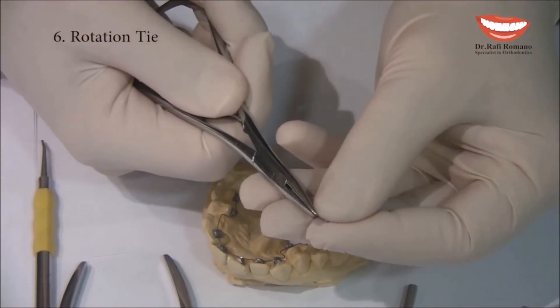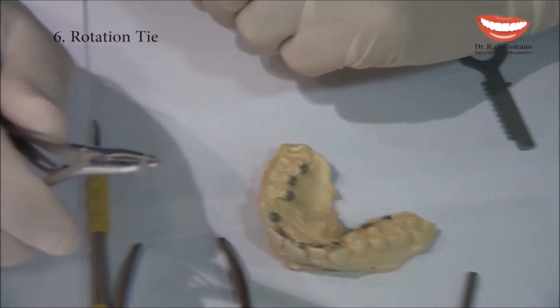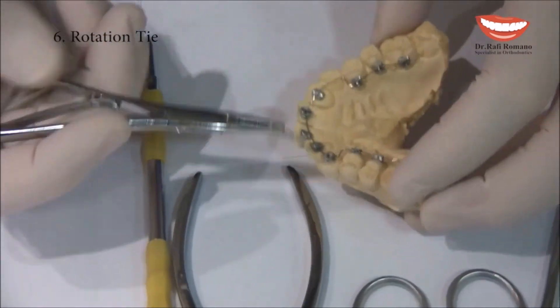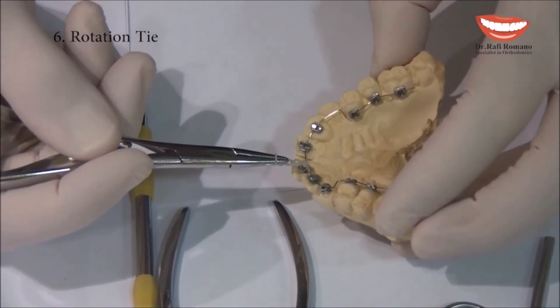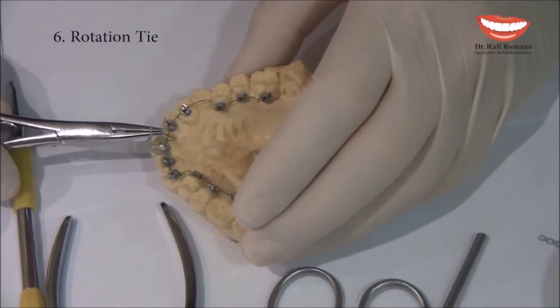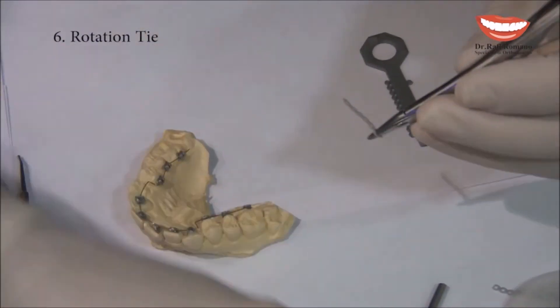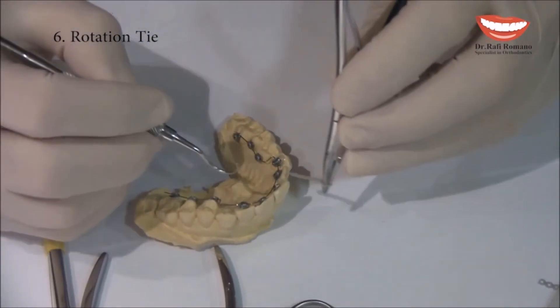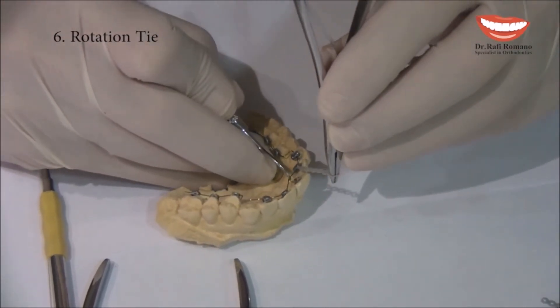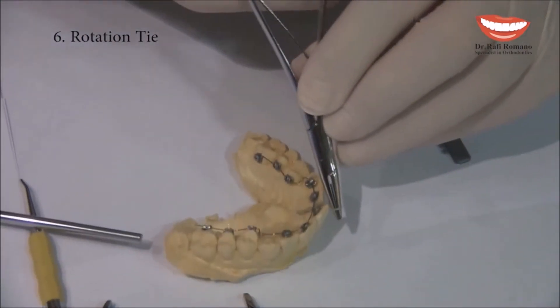What we do: we take the mosquito, put it inside the first part of the chain, then take the chain under the wire. You can use the help of an explorer to take the wire a little out and then take the chain under the wire.